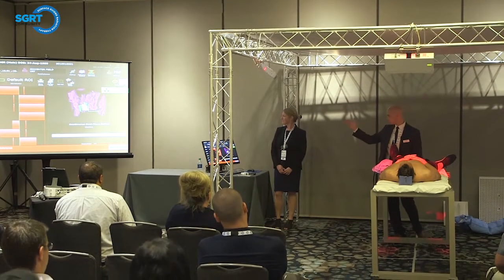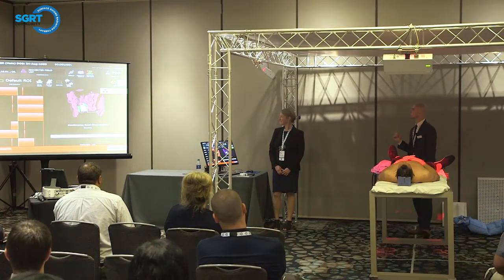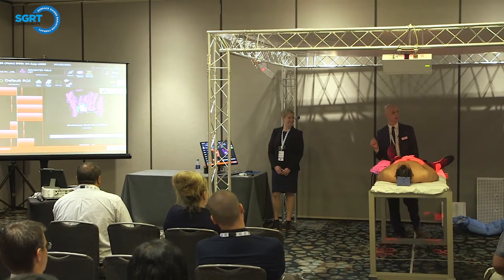Okay, so the ROI is located in what region? Can you guys tell? His knee, yep. So it's the knee that we want to move. So we want to ensure that that is setting up correctly.